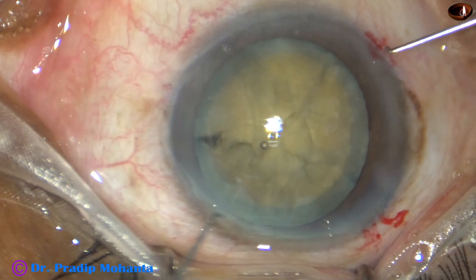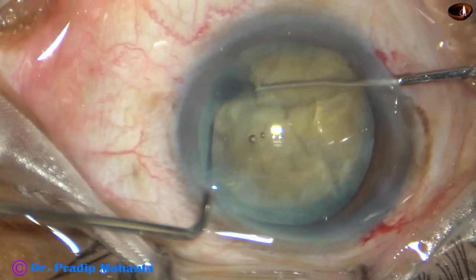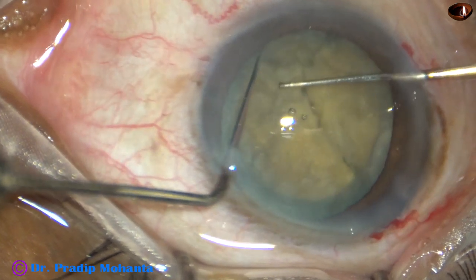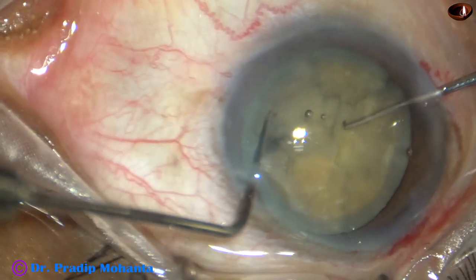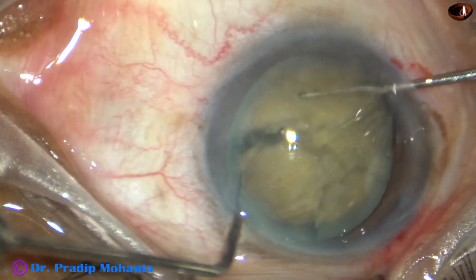Two instruments go through the two side ports and I try to separate the pieces. But I find that the leathery fibers are too tough and they are not giving in, so I also give in.